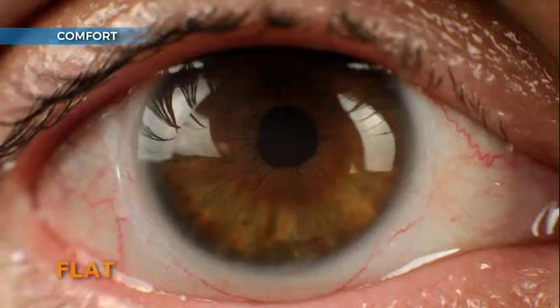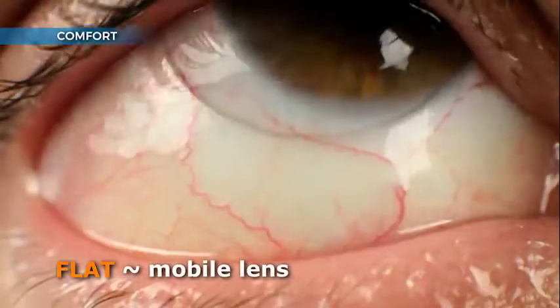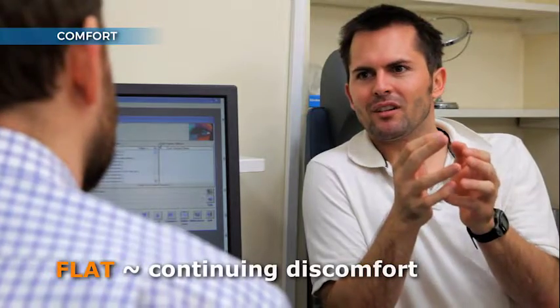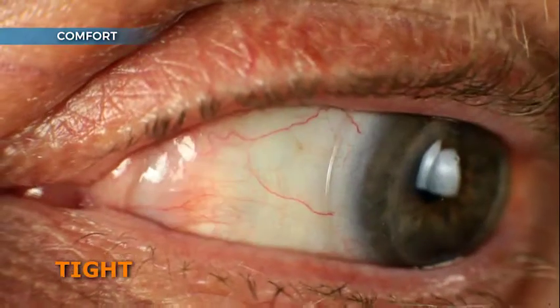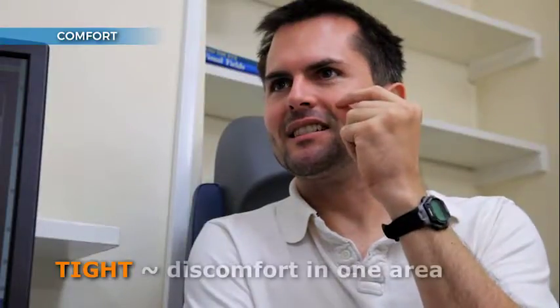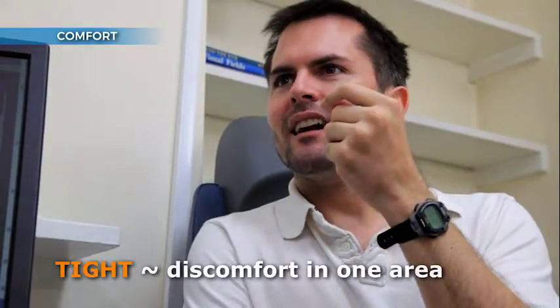If a lens is fitting significantly flat and is mobile, the patient will report discomfort which will not settle with time. A tightly fitting lens may initially feel very comfortable, but after a while, the patient may report general discomfort in one specific area.